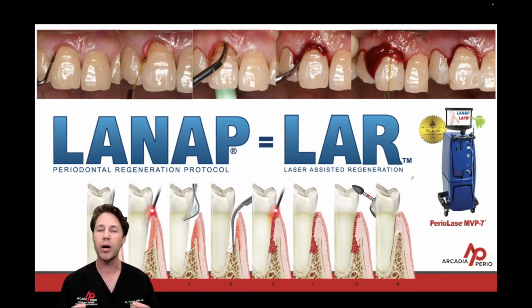So there's no more bone grafts and there's no more collagen membranes when it comes to bone regeneration using this protocol. What will happen is that blood clot in the hemostasis mode will allow for those live viable stem cells to regenerate and turn into bone over time.